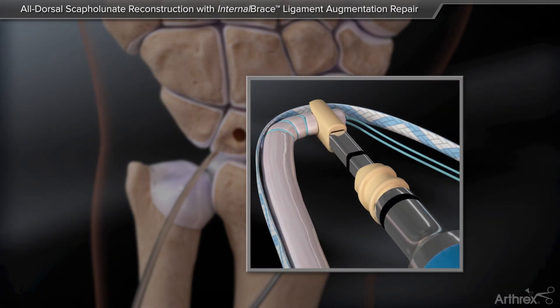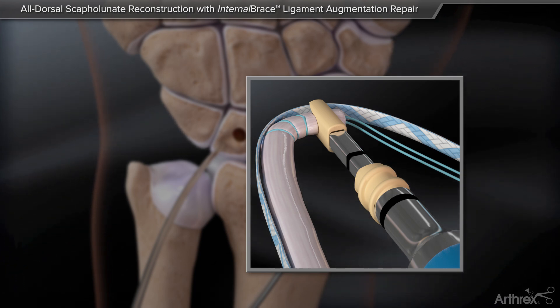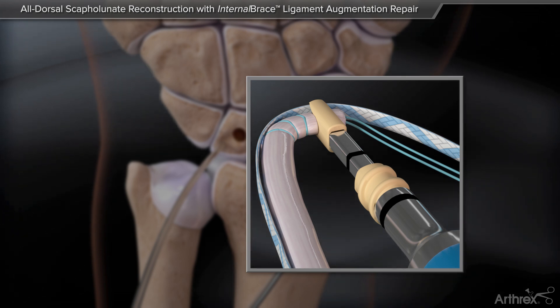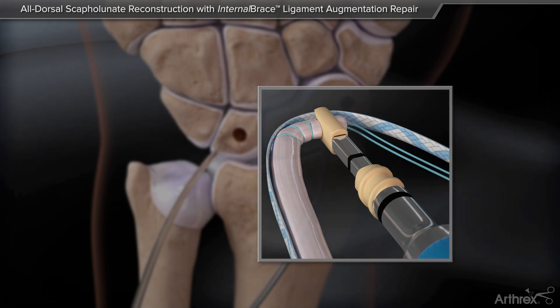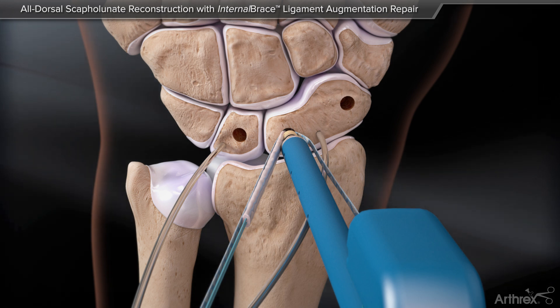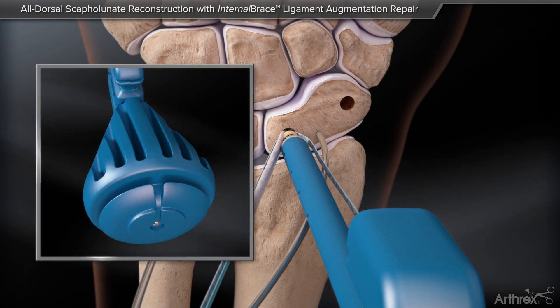Place the very end of the ECRB graft on the forked eyelet. A suture tape suture is placed over the graft, and both the fiber loop and suture tape are secured into the notch on the swivel lock tab. Insert the swivel lock with the graft-suture construct into the proximal pole of the scaphoid until the leading end of the anchor body is flush to the bone.